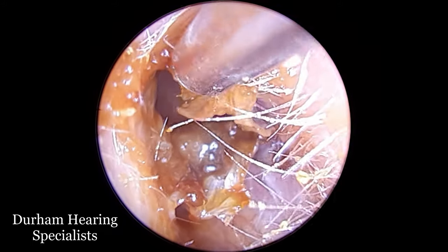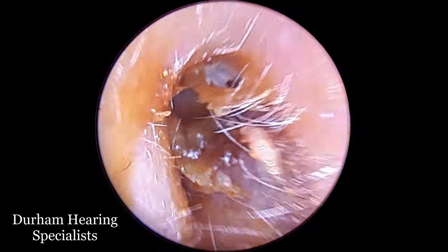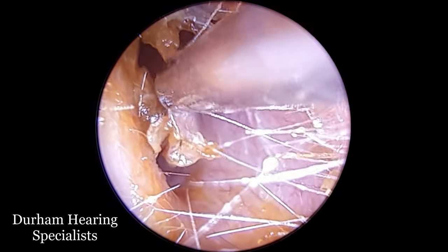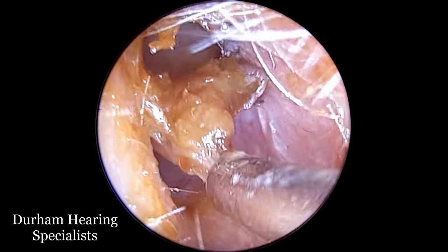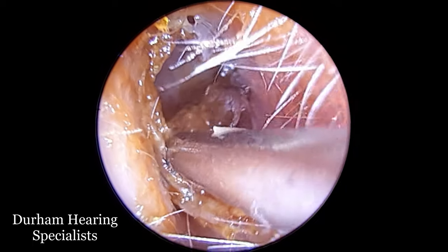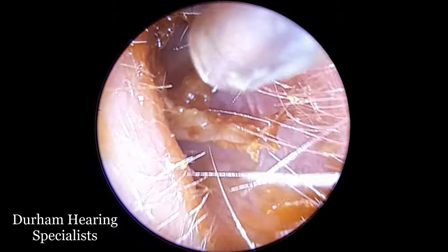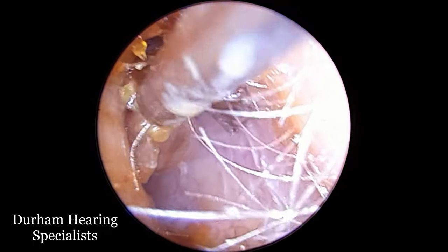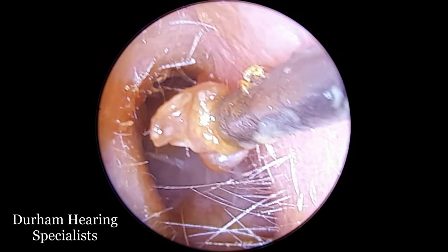So I've gone back to the fine end and what I'm trying to do now is move it down and peel it off the ear canal walls. We're going to grab most of it in one big chunk. Moving in and just wiggling it to try and loosen it off the ear canal. The patient wasn't in any discomfort here, so I was fairly confident I was not pulling on anything that was going to hurt, like the eardrum for example. Moving in, catching it from the side, and we should hopefully see this all come out in one gigantic plug — and there we have it.